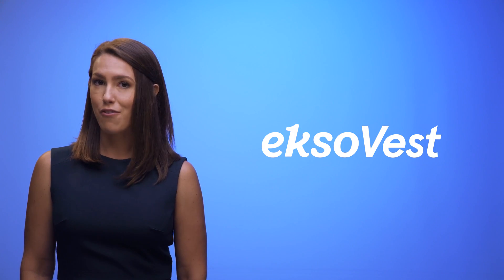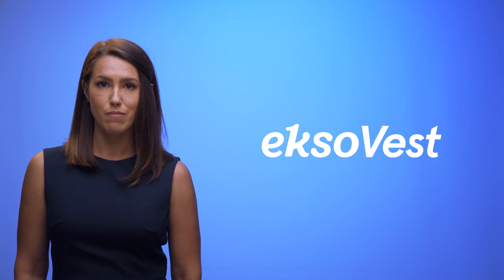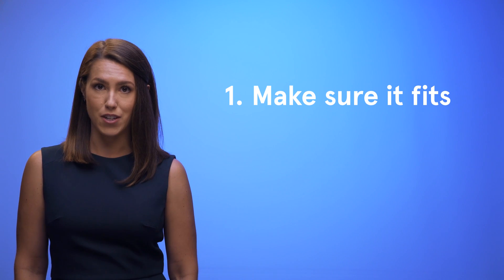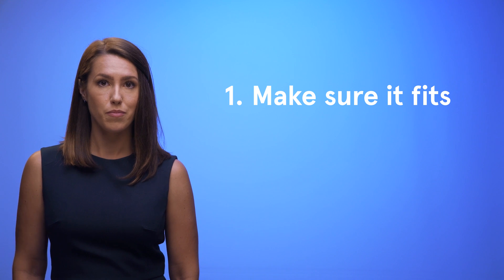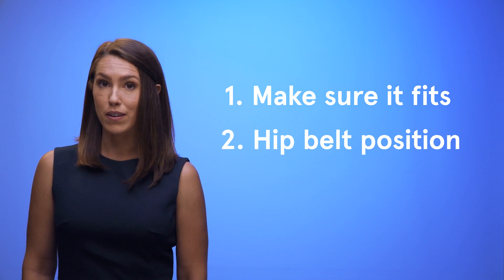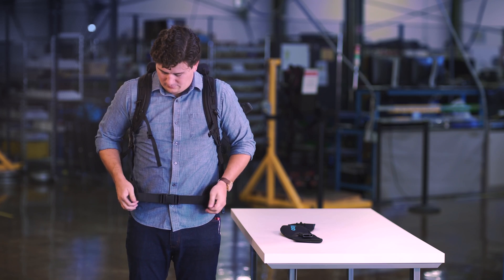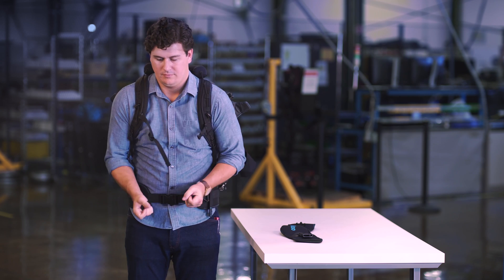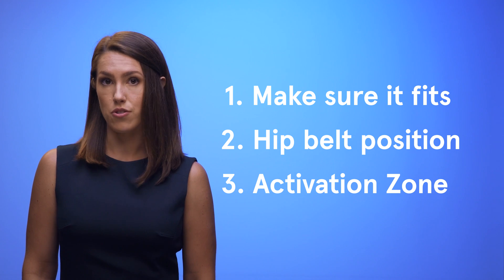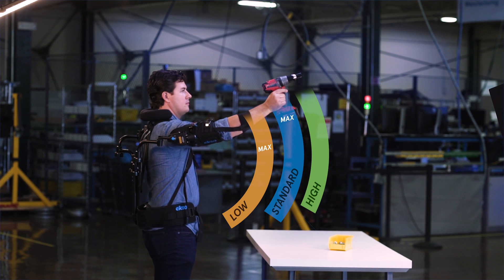In this video, we've covered everything you need to know to get started with your ExoVest. Just remember three things. One, your ExoVest only works if it's correctly fitted to your body — know your measurements. Two, your ExoVest only works if the hip belt is positioned properly over your hip bones and cinched tightly; if it's above or below, it's uncomfortable. Three, your ExoVest only works when your arms are in the activation zone. The farther your elbows are from your sides, the more your ExoVest helps.